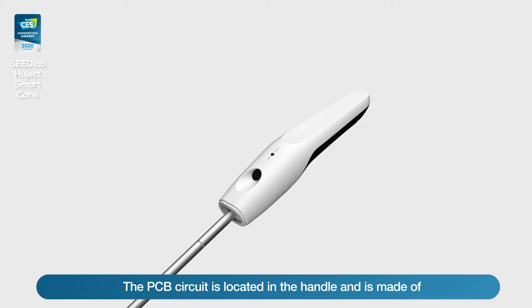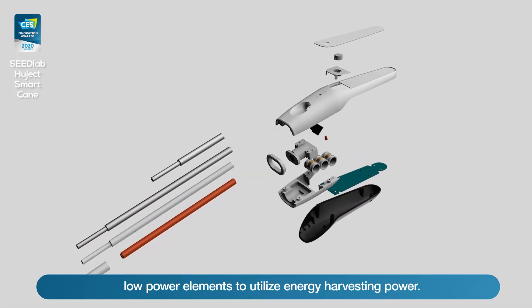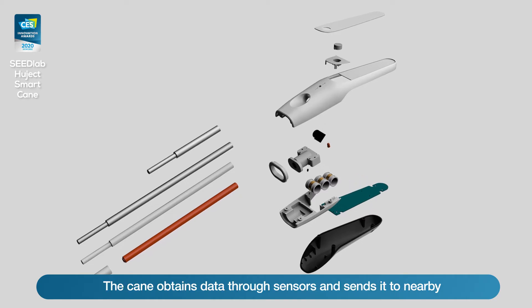The PCB circuit is located in the handle and is made of low power elements to utilize energy harvesting power. The cane obtains data through sensors and sends it to nearby smart devices through communication modules to process the data.